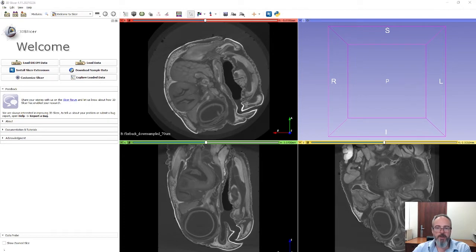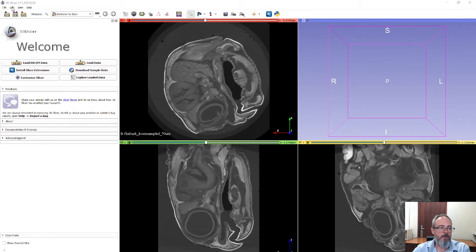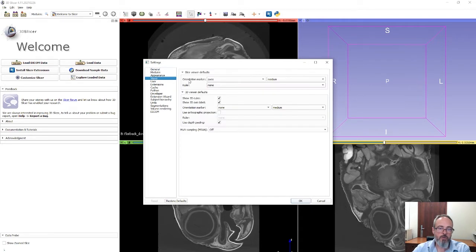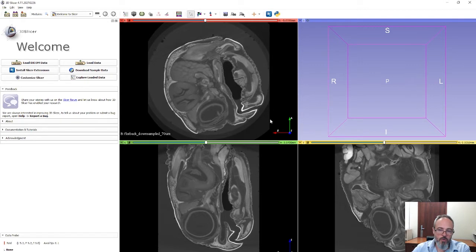First things first, let's visualise the data so that we don't get confused. What you want is to have the axes visible in the viewer, which you can set by default by going to the Edit Application Settings Views menu and ensure the orientation marker is set to Axes. It does require a restart, so do that before you load your data in. You want to make sure that your three viewers are always in axial, coronal and sagittal view.